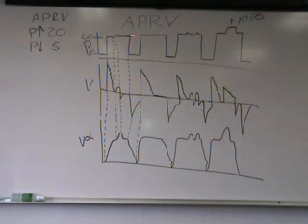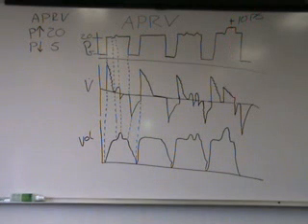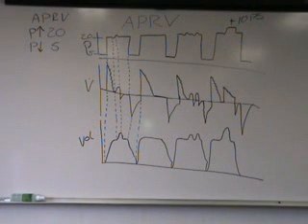Spontaneous breathing can occur at both levels, and if pressure support is added, the pressure support is patient triggered, pressure limited, flow cycled ventilation. In a nutshell, the patient is allowed to breathe spontaneously at two different pressure levels, and pressure support can be added to boost those spontaneous volumes.